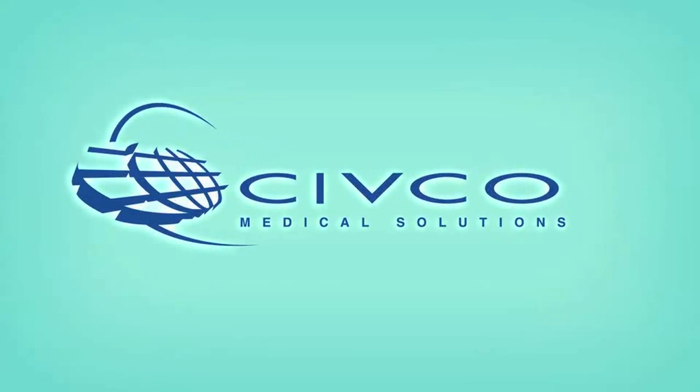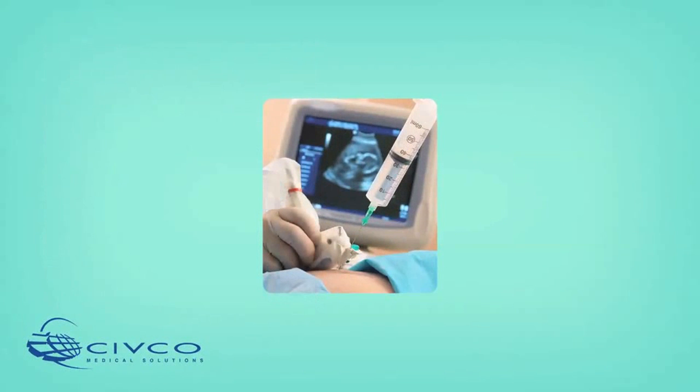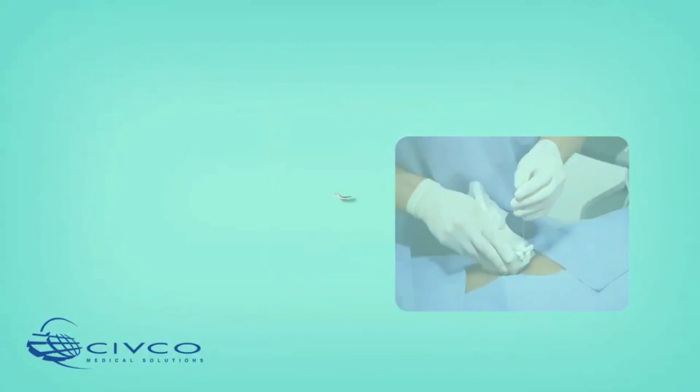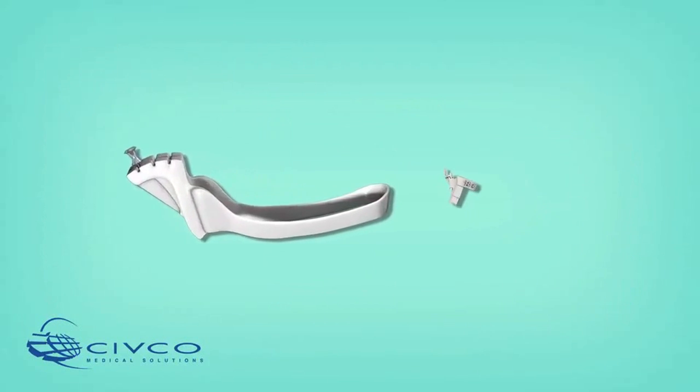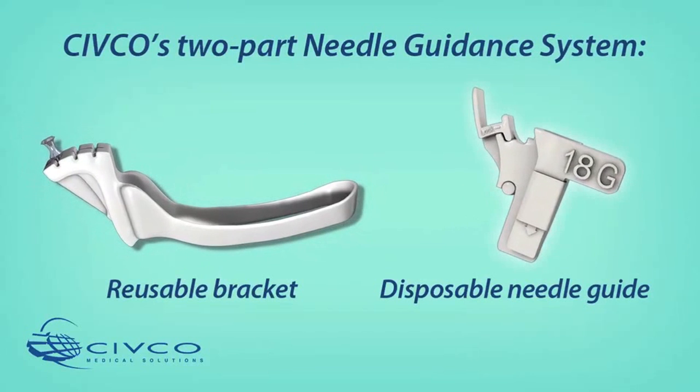As the leading supplier of customized ultrasound needle guidance systems, Civco is committed to providing healthcare professionals with solutions for increased clinical confidence and to improving patient and staff safety during puncture procedures. Civco's complete line of needle guidance systems utilize a two-part system consisting of a reusable biopsy bracket and a disposable snap-on needle guide.